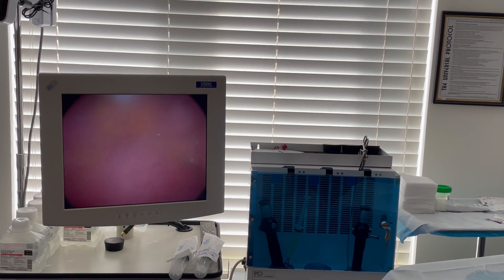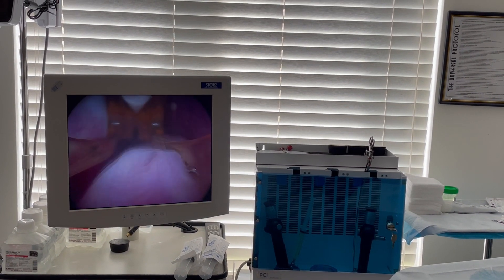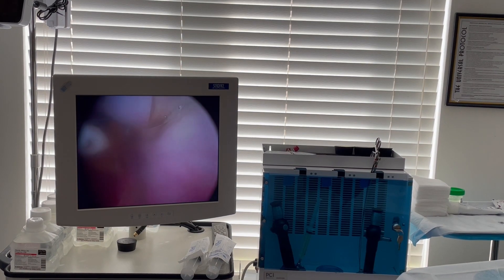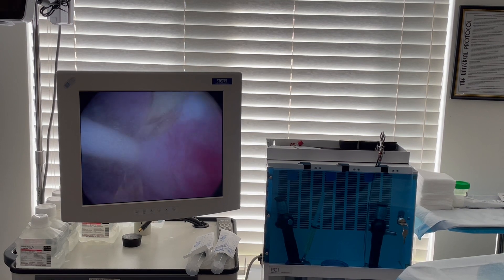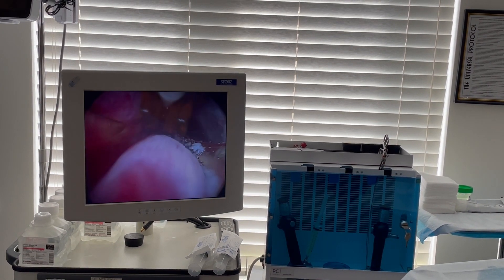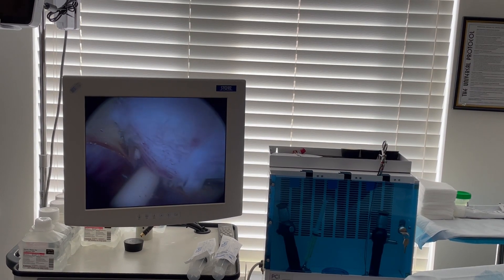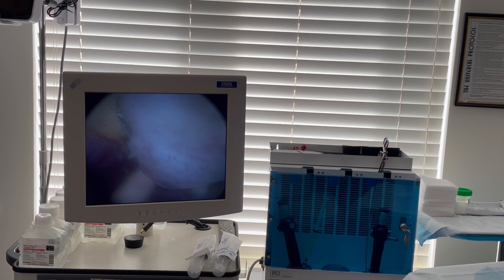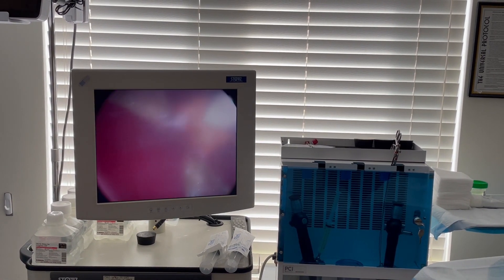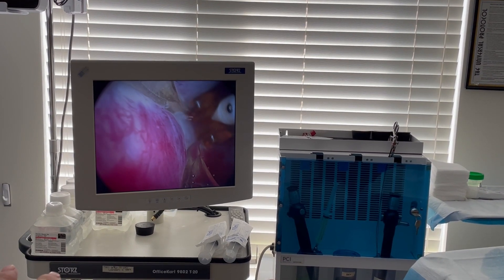So we're in the bladder here. There's a pretty open bladder already — this is going to be a real quick one I think. One centimeter still. I see it dropping down, so I'm gonna come up here and do another stick. Normally I would ask him to open his legs a little bit more, but because he's on the nitrous it's a little bit harder. You see that? He can still hear me, so we're good.